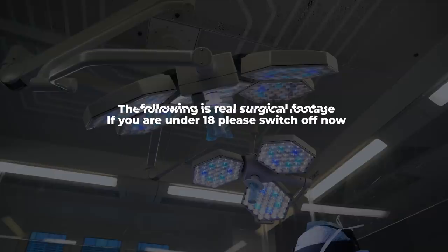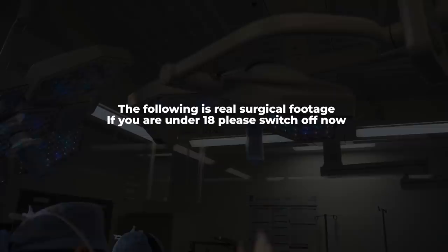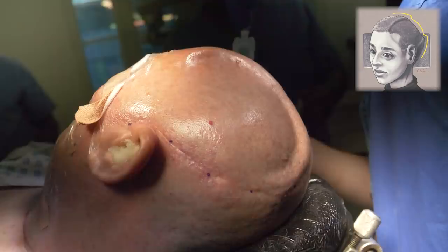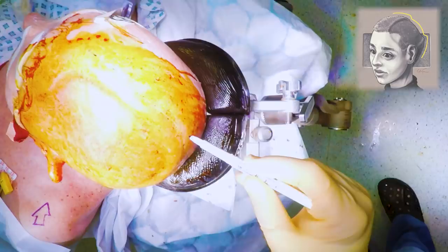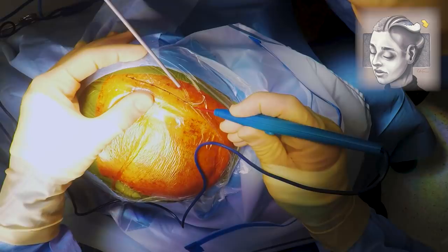What follows next is real footage of a cranioplasty plate being inserted, so if you're under 18 please switch off now. This image by Artebiotics shows how a patient's head would look without the skull — there's just skin overlying the brain and it's covering there at this point. So we now need to make a cut through the old scar and get down towards the brain and start to take away all of the scar tissue away from the bone edges so that we can fix the cranioplasty plate in place. At this point you can see that Mr Uff is going to be opening the old incision along the same scar.